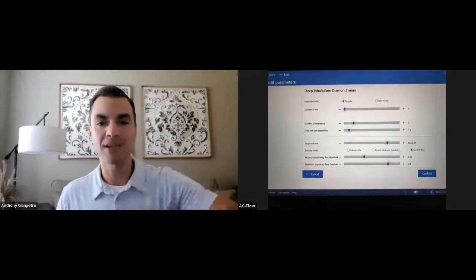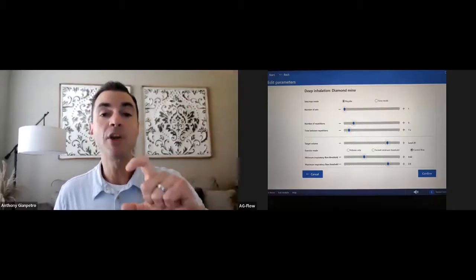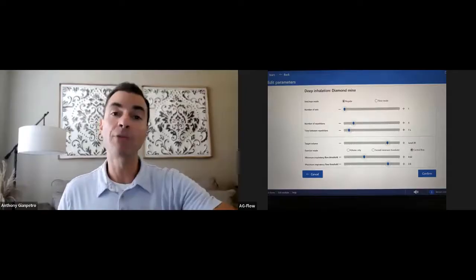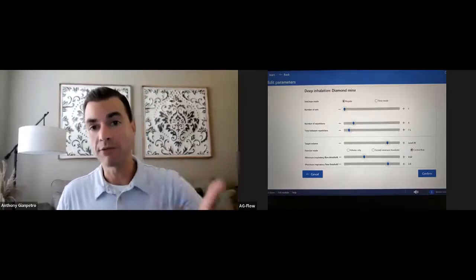So stalactite, top; stalagmite, G, ground. I don't know, whatever helps your mind. But you're now setting that to prevent the patient from overly being powerful with drawing air in. It helps keep the cadence that you want for flow.